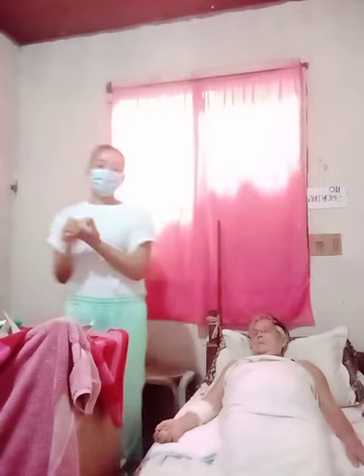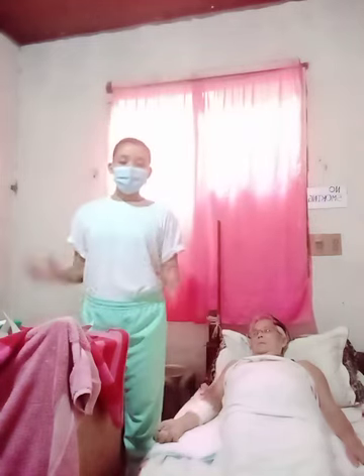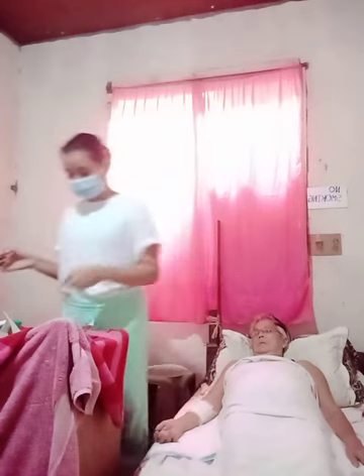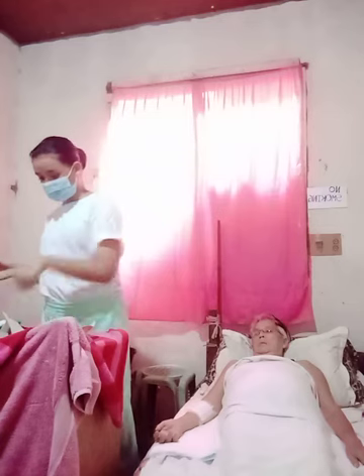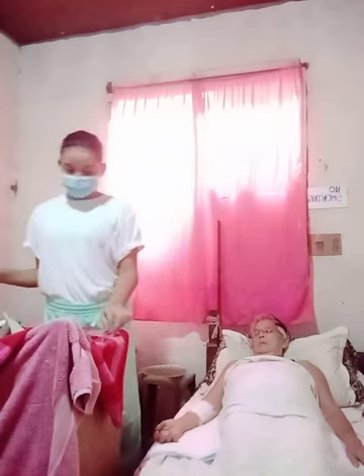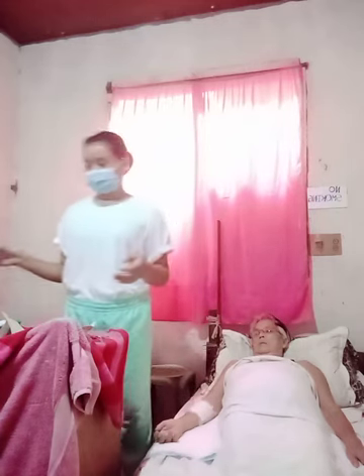Right now we're going to demonstrate wet-to-dry dressing. For the first procedure, pour the prescribed solution into a sterile basin. Then add the fine mesh gauze.